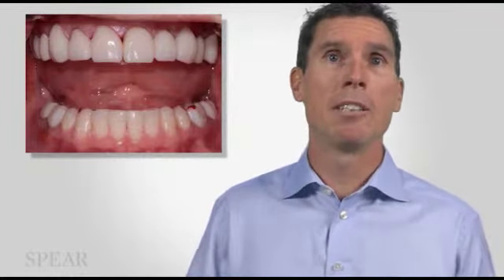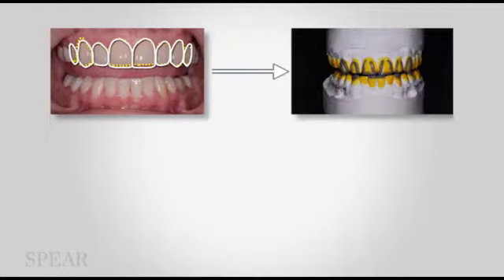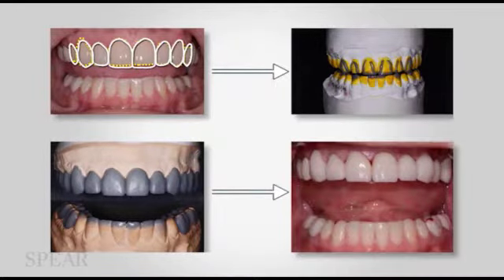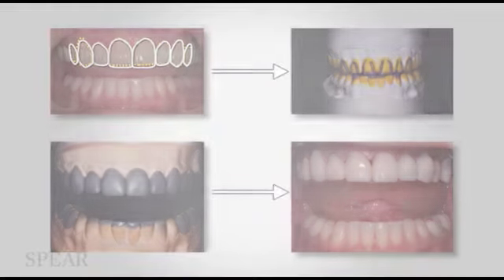That's the neat thing about this. And so now we can give her a different plastic for a while and just verify that she stays really good. And she does. So what I did is I cemented and I finished adjusting the occlusion. So where we started from was our photographs, putting the edges where they were. We went to our models and worked out the function. And then we had our lab technician create a model that looks exactly like we want it to be. And then it actually looks exactly like that on the day we finish putting all these provisionals in. There shouldn't be any surprises. Predictability goes up amazingly, right?